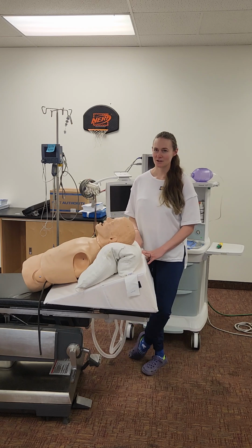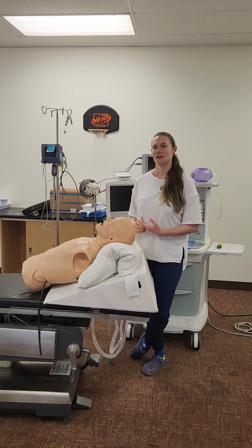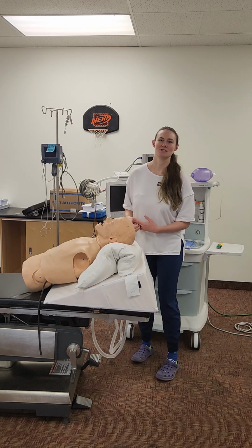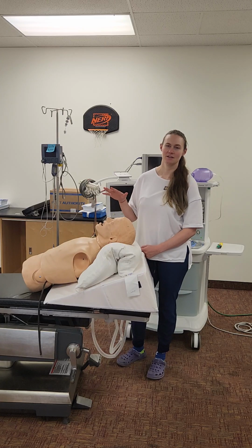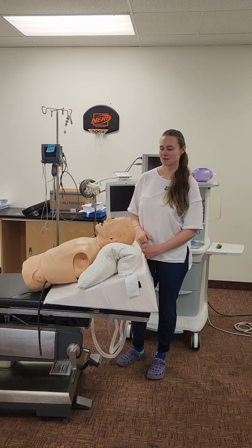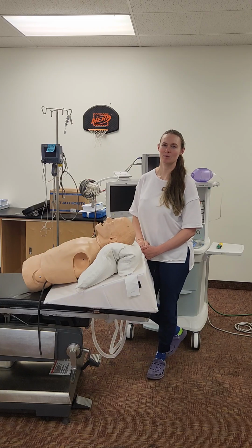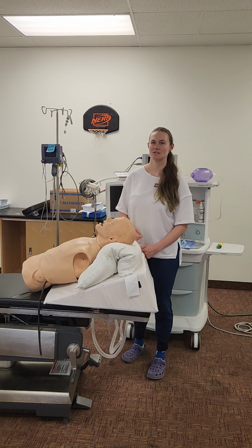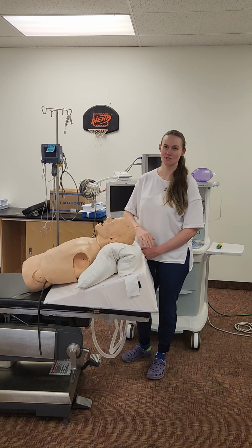I'll have a fiber optic scope, I'll have a difficult airway cart nearby, a couple LMAs, some oral airways, and then my cric kit if worst comes to worst, and then some bougies. And then some ETTs. I'll have an 8.0 predicted, but I'll have about a half size up and half size down. I'll have my stylet, my lube, and then I anticipate securing the tube around 22 to 24 centimeters at the lip. And then I'll just have some positioning equipment, so egg crate foams, an OG tube just in case, and suction. He's overweight, so he likely has GERD too.